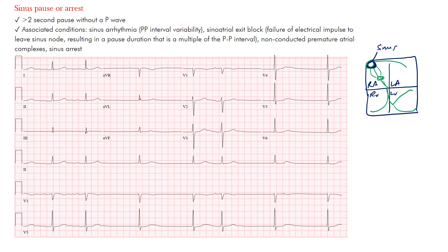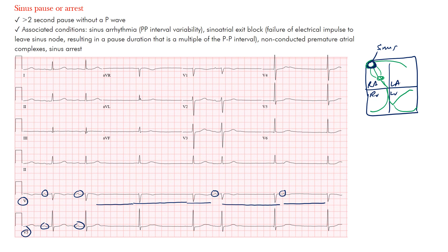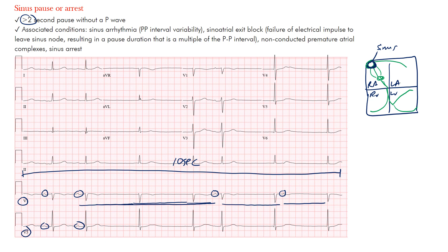We're looking for no P wave for at least two seconds. Notice here in V1 and also in V5 there are P waves occurring, and then there's a period with no P wave whatsoever until this point here, and then again no P wave until here. The total standard 12-lead from beginning to end is 10 seconds, and we're asking for at least a two-second pause. From right here to that point, measuring it out, that's almost about four to five seconds of a pause without any P wave.